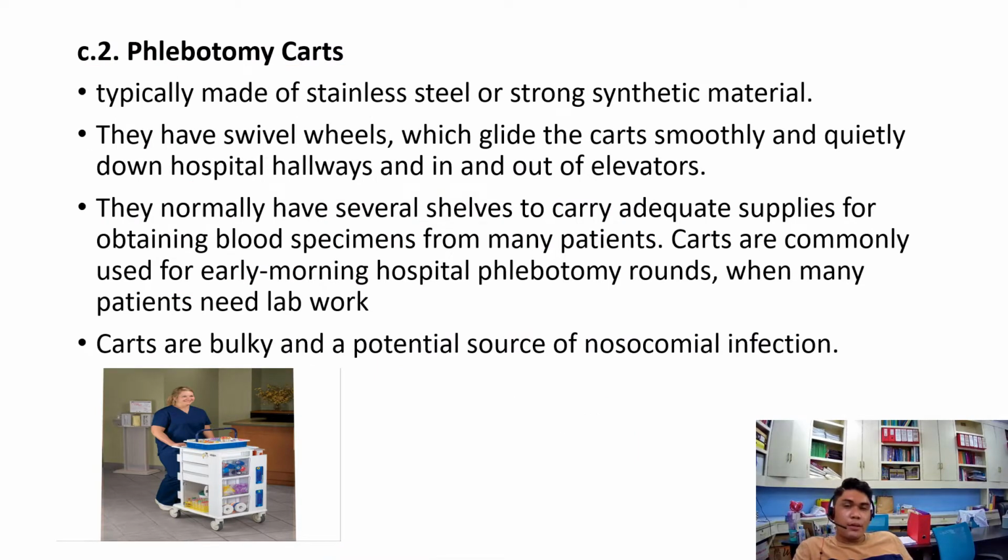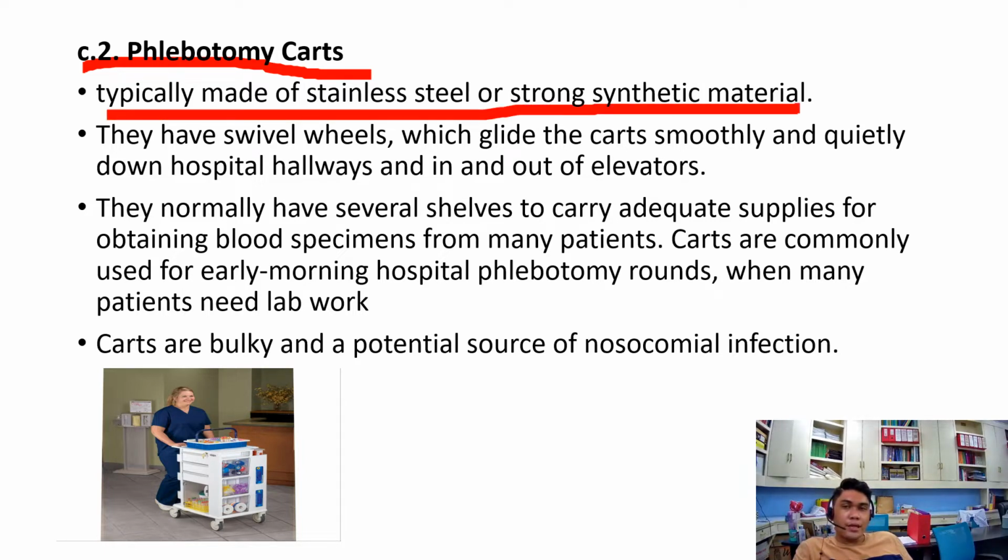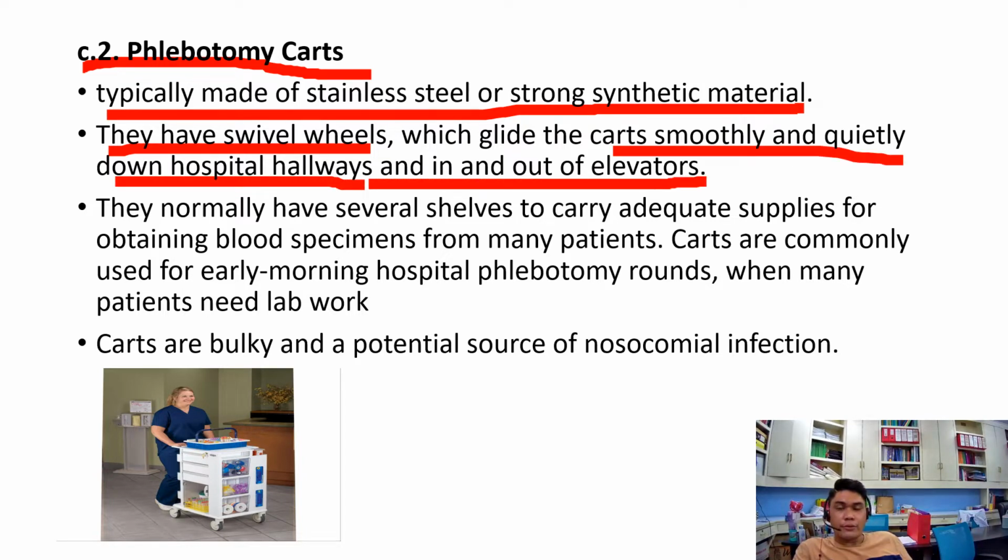Another equipment carrier is the phlebotomy cart. Phlebotomy carts are typically made of stainless steel or strong synthetic material, and they have swivel wheels which glide the carts smoothly and quietly down hospital hallways and in and out of elevators.